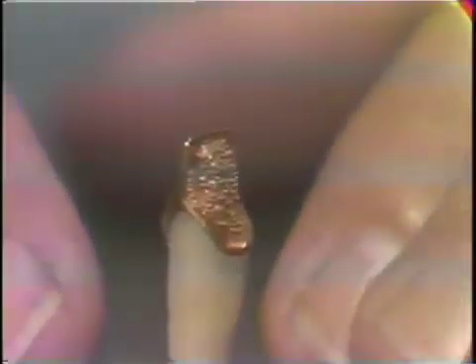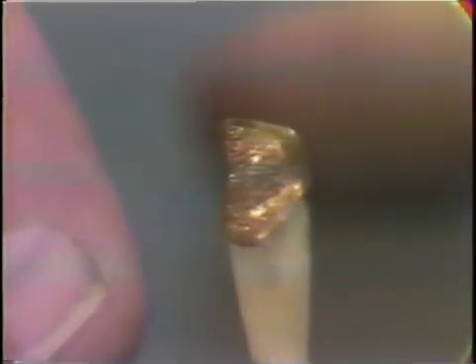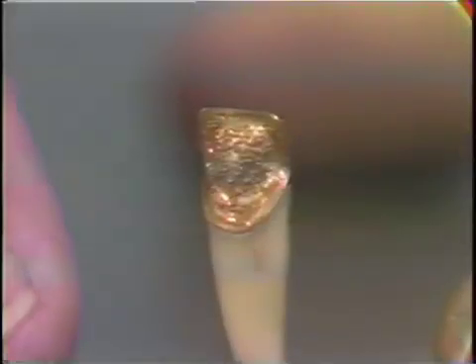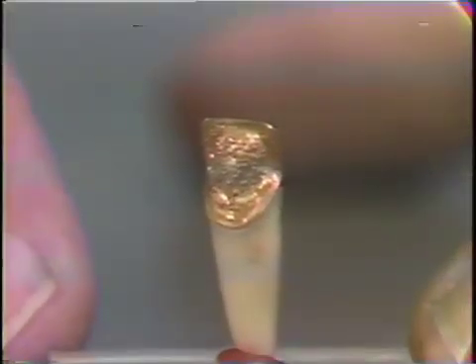When we use acrylic resin, we give incisal protection to it, so you can see the incisal layer of gold going across there. Notice the preparation follows the contour of the soft tissues. High interproximally, it drops down on the lingual surface, rises again to the other interproximal, and drops down on the labial, and the preparation is carried, of course, beneath the gingival margin there, so that the little margin of gold there will be hidden from view.